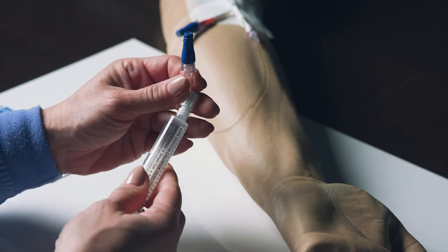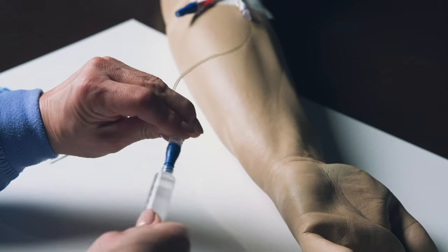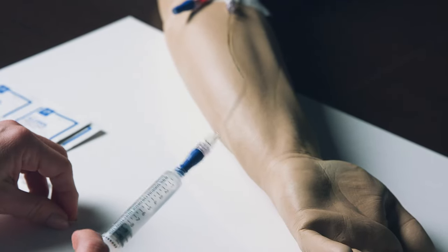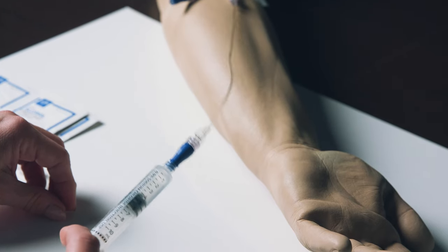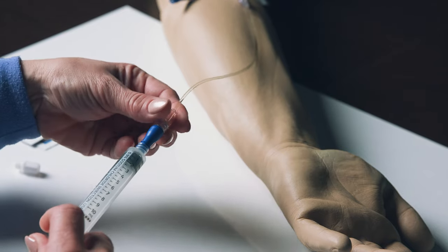Flush your IV catheter with the prepared sodium chloride. Push and twist the saline flush syringe onto your IV injection cap. Flush using the push-pause method as instructed by your healthcare professional. Then remove the syringe from your IV catheter.